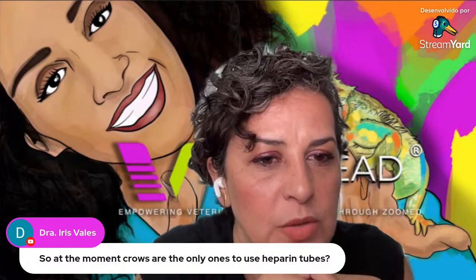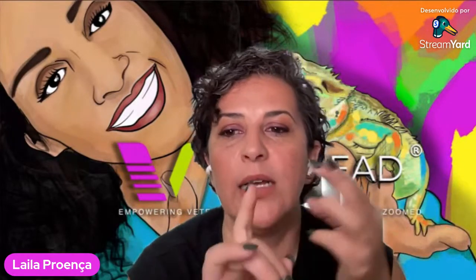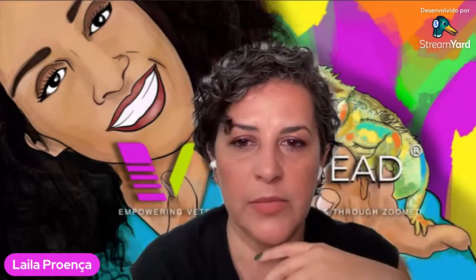So at the moment, crows are the only ones to use heparin tubes. Well, crows, if we're talking about, oh, okay, heard the others. Good, good. But just in case again, crows, the Anatidae family, which are the swans, the ducks, the geese, and then the cranes and hornbills, in case you see them. Sometimes we do see them, as some people have them as collectors.